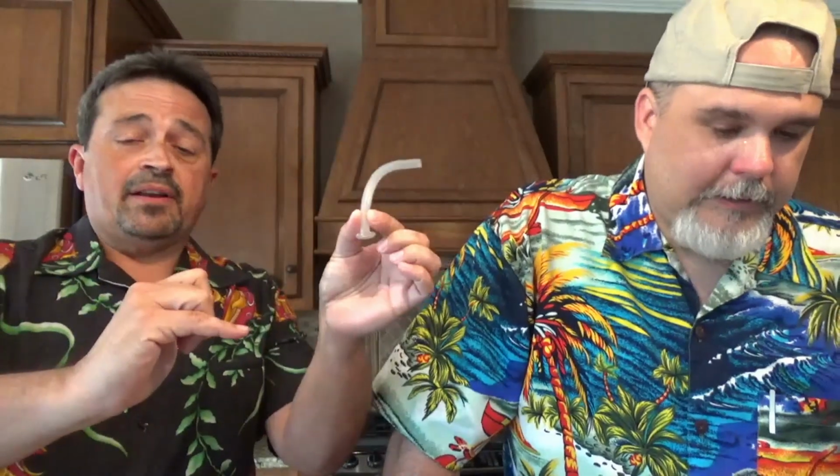So what you... Well, I don't know if we want to reshoot or not. But anyway, a couple of things you can do. There are brands that have a flange that moves. And in that case, when we got to where you started having a gagging, we moved it up a little bit.